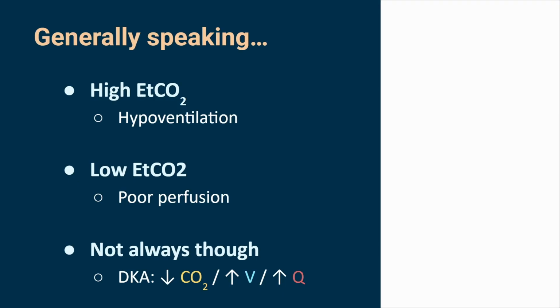Look, let me put you on end tidal real quick. Just see what that says. This is your measure of your CO2 instead. And his end tidal comes back as 31. What did I just learn? He's hypocapnic. It is implying poor perfusion. That is a sign of hypocapnia. What might that mean?